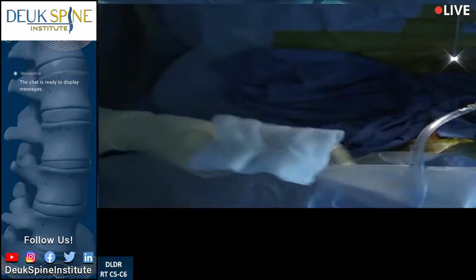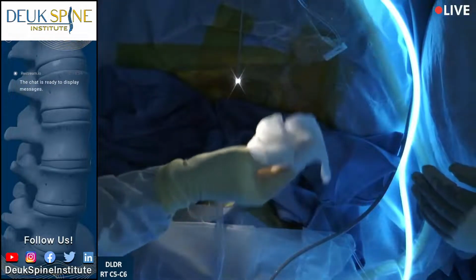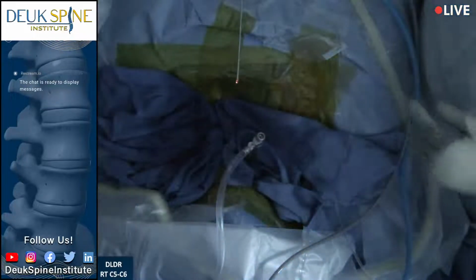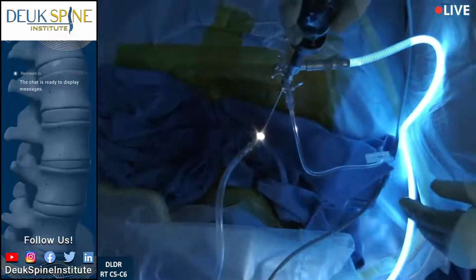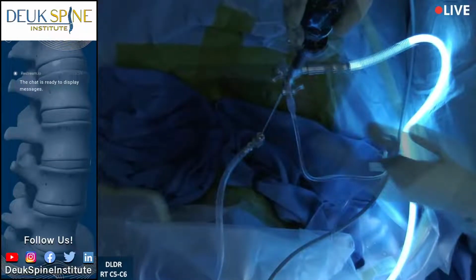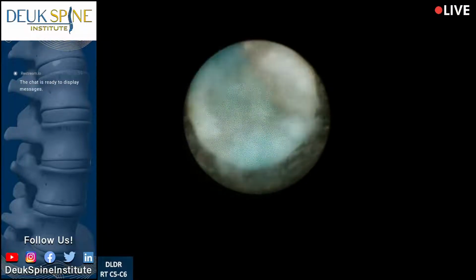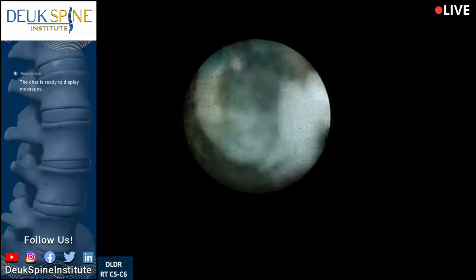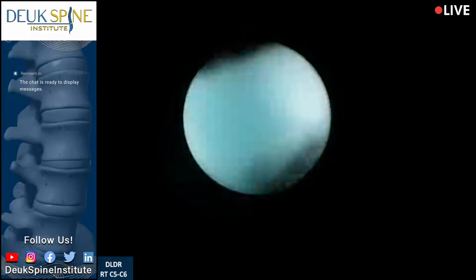Now she's traveling, I know originally she's from Indianapolis. That's a nice little piece of herniation there. Just came out. Lives in Tampa now. They're smart to get out of Tampa and get off of the West Coast where the hurricane's coming, right? What is it called? Hurricane Ian, or what is it? Ian, yeah. Ian.